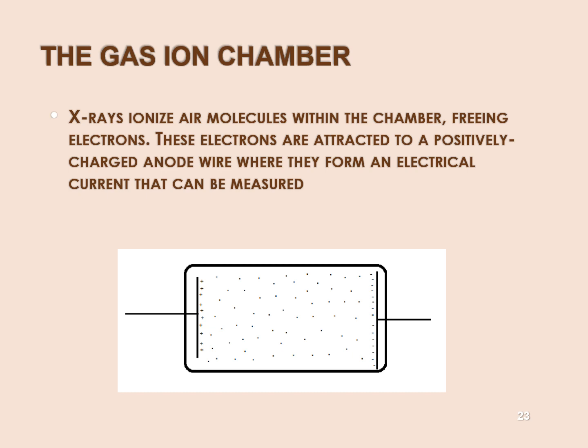That's the anode, so it's got little plus charges on there. And then over on the other side, that's our cathode. It's got extra electrons on a little T-shaped wire, and this will not conduct electricity until the neutral air inside, the nitrogen atoms, become ionized.